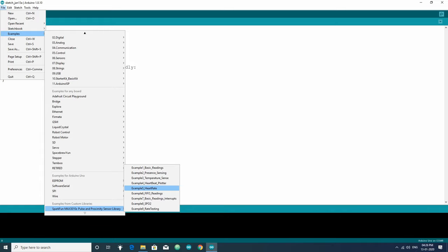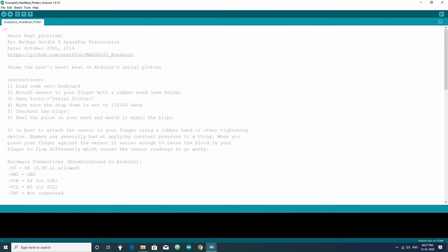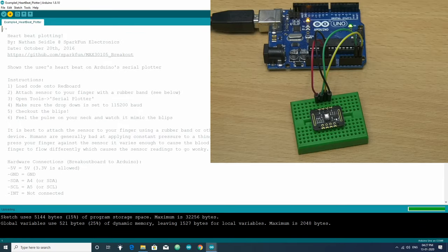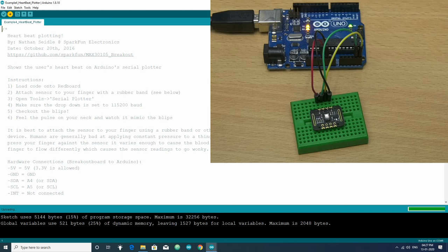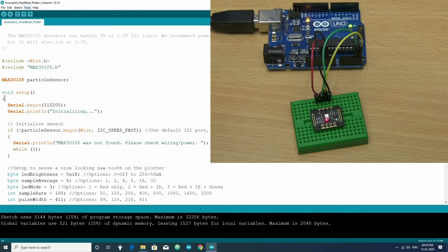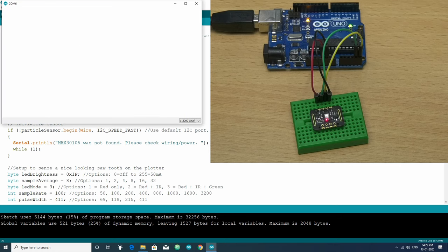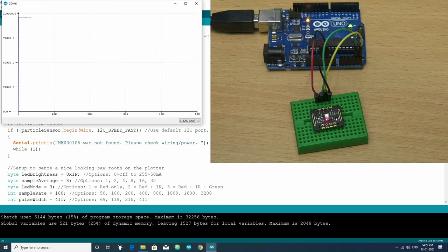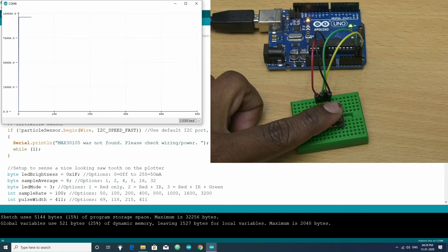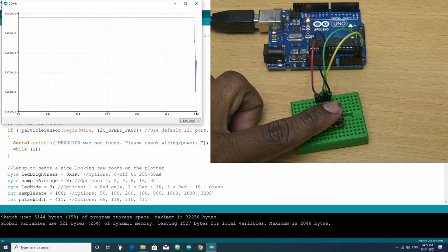You can modify these examples and use it in your project. Let's check the heart beat plotter sketch. Choose the correct board and upload the sketch and then open serial plotter. Now put your finger in the sensor and you will get the heart beat in the serial plotter.